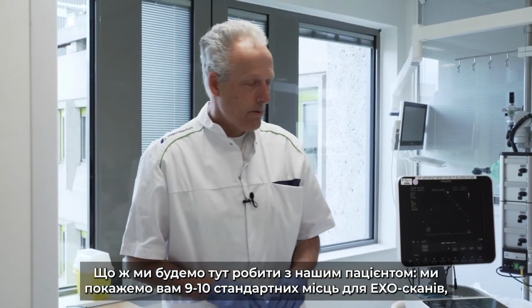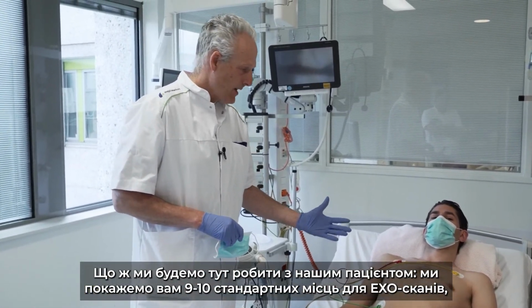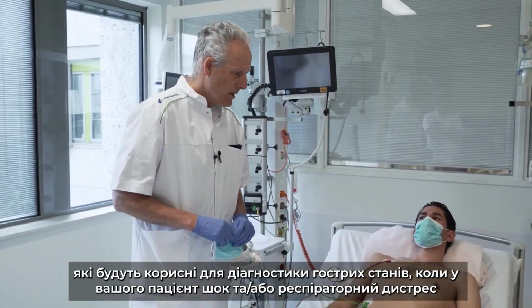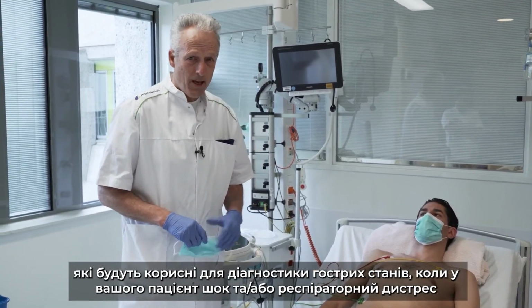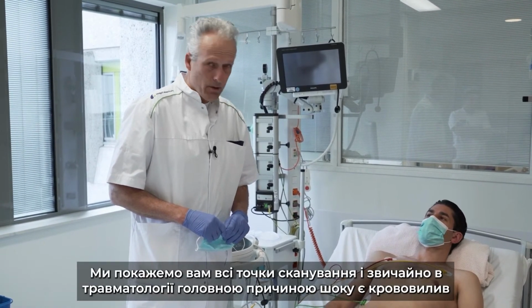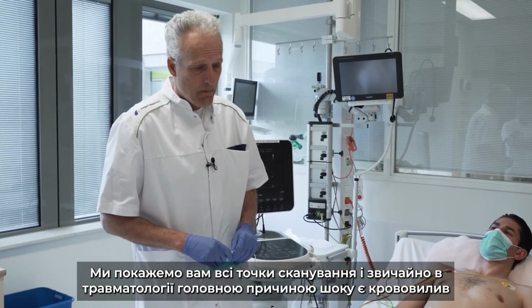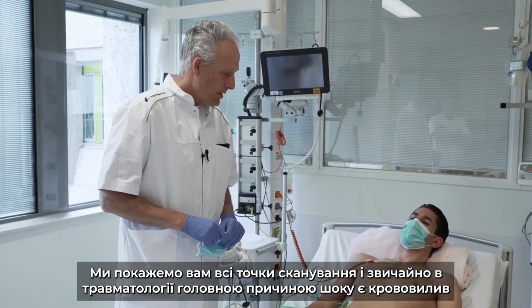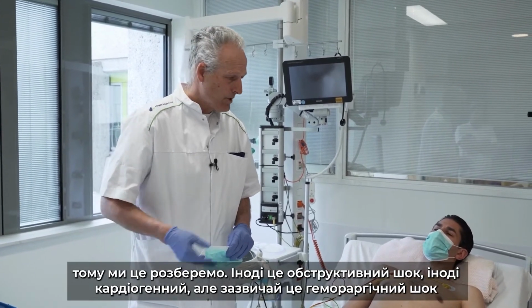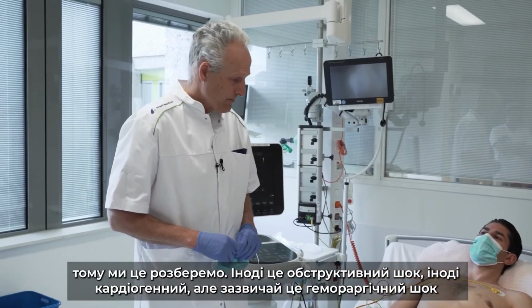What we are going to do with our patient here, we will show you 9 or 10 echo windows which are useful in the acute setting when you have a patient in shock and or respiratory distress. We will show you all the windows, and of course in traumatology the main cause of shock is hemorrhage, so we will say something about that. Sometimes we have obstructive shock, sometimes cardiogenic shock, but it's mainly hemorrhage.